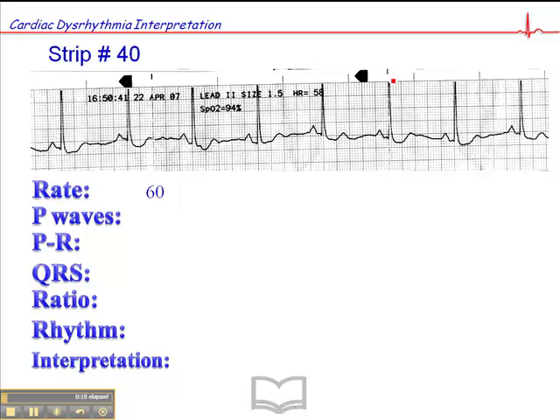Here's a QRS that falls on a dark line: 300, 150, 100, 75, 60. So we'll say fair enough — 58 to 60, somewhere around there.